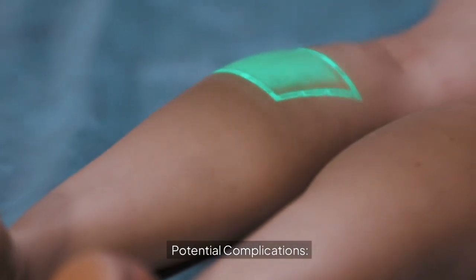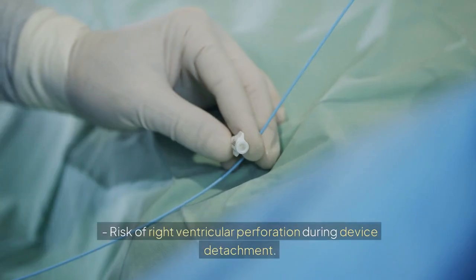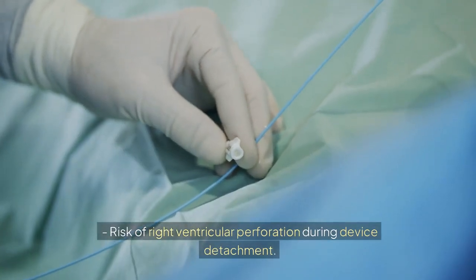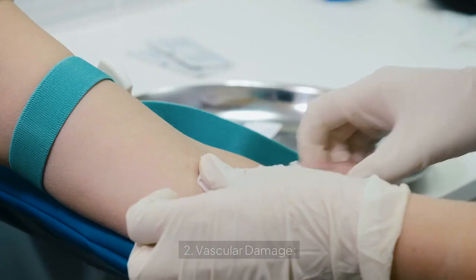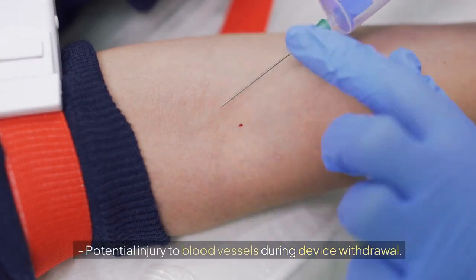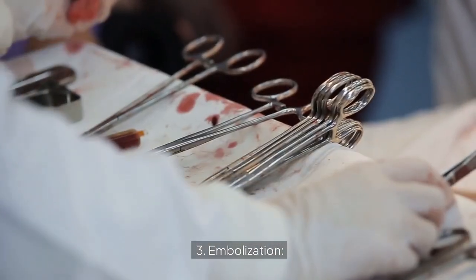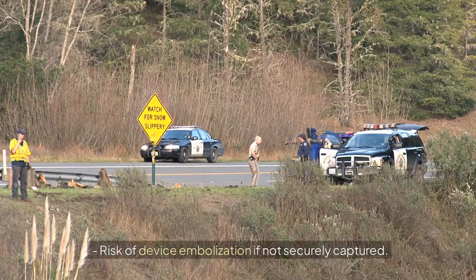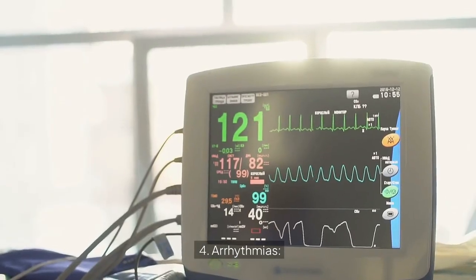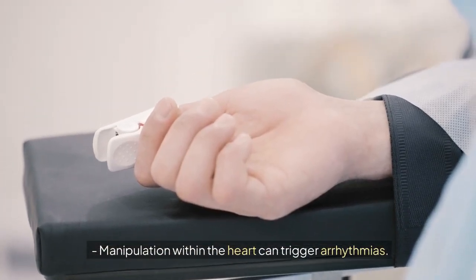Potential complications. 1. Cardiac perforation. Risk of right ventricular perforation during device detachment. 2. Vascular damage. Potential injury to blood vessels during device withdrawal. 3. Embolization. Risk of device embolization if not securely captured. 4. Arrhythmias. Manipulation within the heart can trigger arrhythmias.